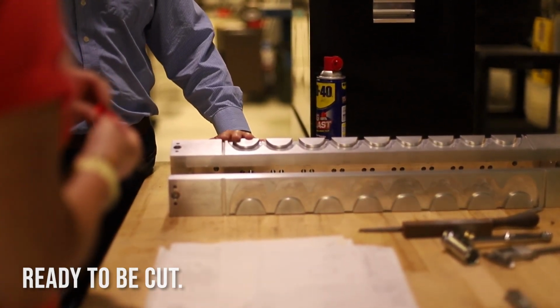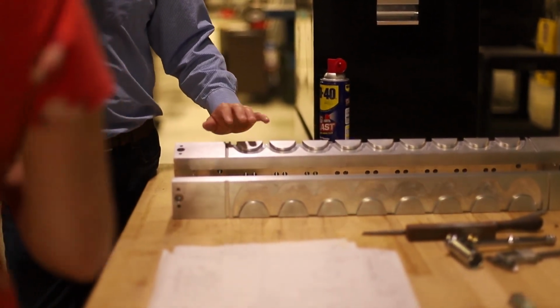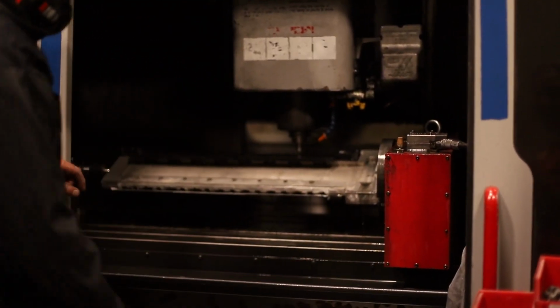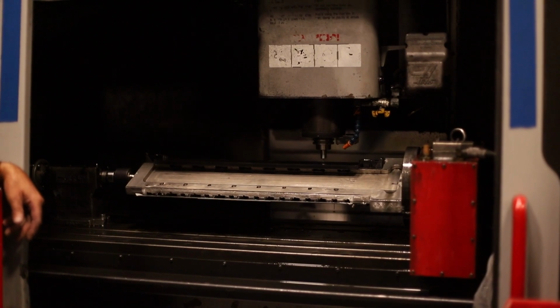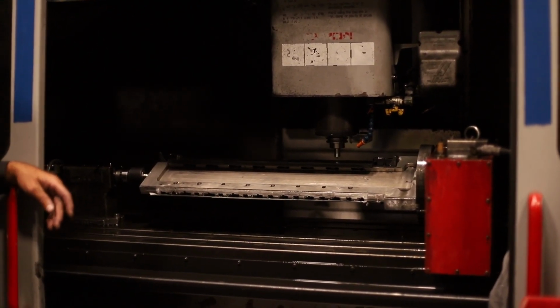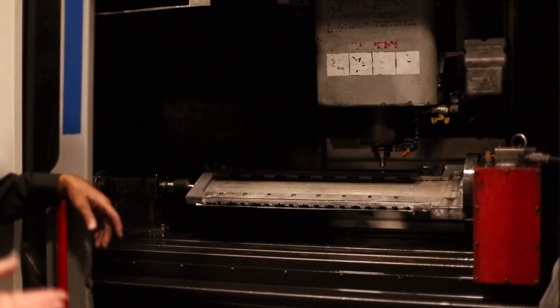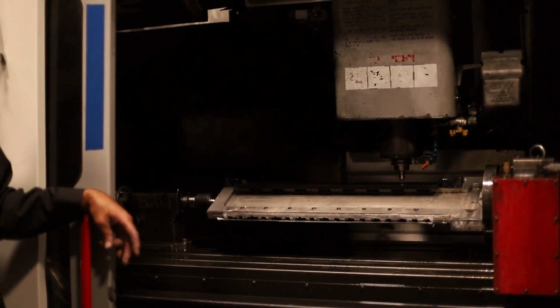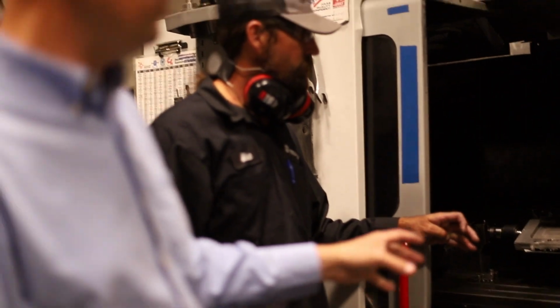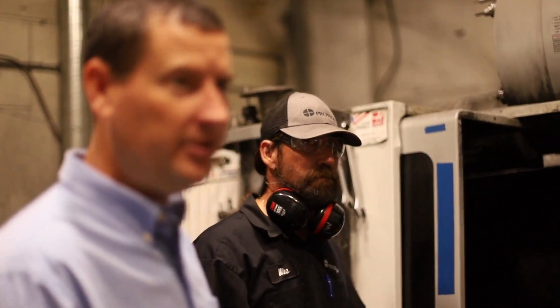Then we'll cut it out with the CNC mill. And this is a fixture to hold it while we're cutting. We'll bolt it on a fixture just like that one we were building, and then router bits and different kinds of cutting tools will go and cut the profile out. So this is the machine that actually cuts the individual feet out.